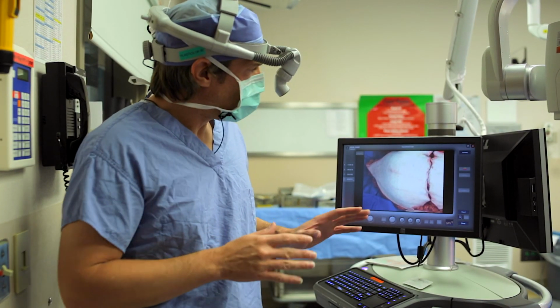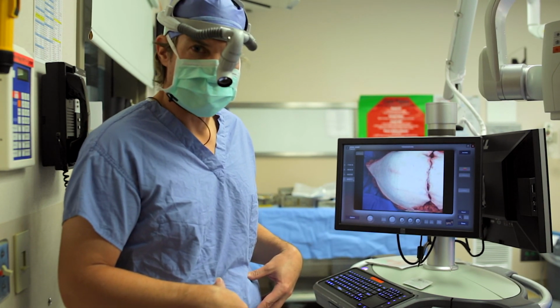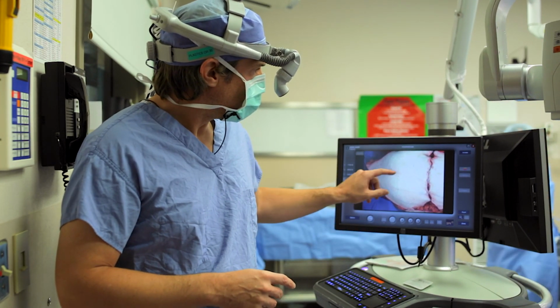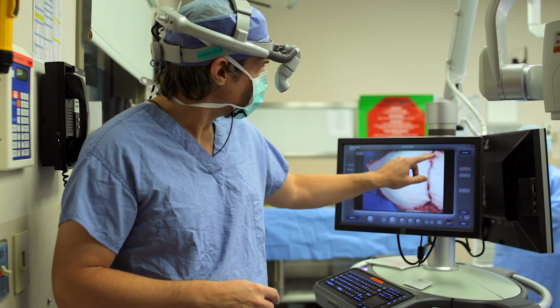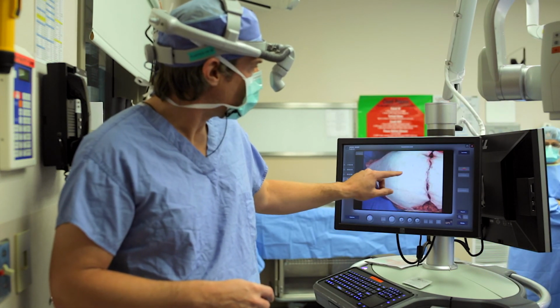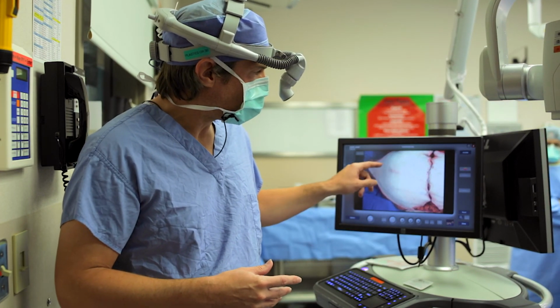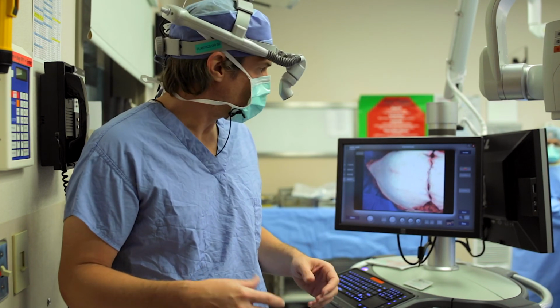And clinically, what we were doing is bilateral abdominal flaps for breast reconstruction. What you see here is just a regular standard picture of the right-sided abdominal flap. This is midline, and here's where the umbilicus was. It's hard to see on this picture, but you see that she's had a scar right here, and that's from a previous appendectomy. So the question in this case was, how does that previous appendectomy scar play a role in the perfusion of this flap as we're going to use it for breast reconstruction?